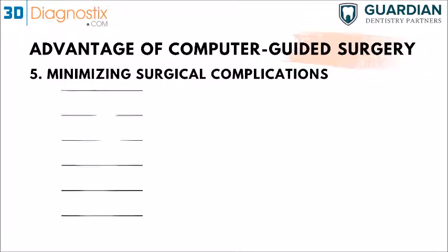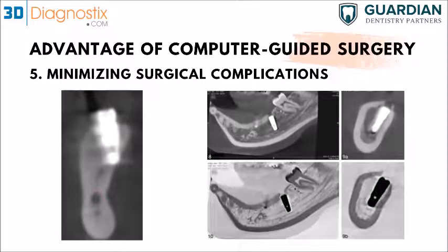And then it also minimizes the surgical complications. So here we're going to find two screenshots, one on the left and one on the right. Those are examples of implants that ended up in unfavorable positions without using the guidance of the templates that we provide. So you can see that sometimes, even though we do have the experience, we end up having the implant either perforate the lingual plate, or the implant, just because of the density of the bone, sometimes would sink and would injure the nerve. So guided surgery would prevent having those complications.